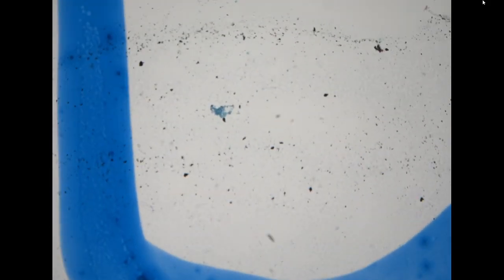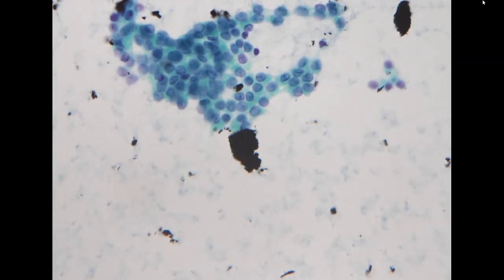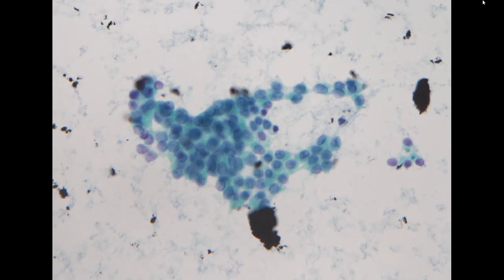So let's move to fine needle aspiration. The first specimen is from the thyroid. This is a very paucicellular specimen. We didn't see a lot of cells, and we didn't see a lot of background colloid as well. There were only 2 to 3 cellular clusters. However, the material that we received is already diagnostic for papillary thyroid carcinoma.